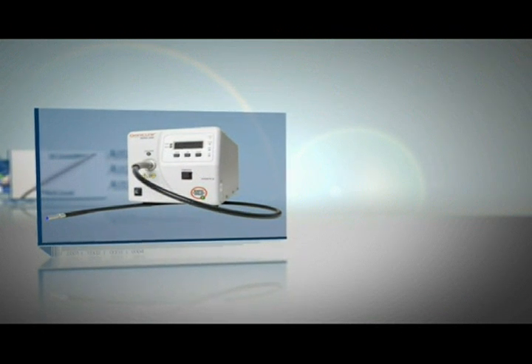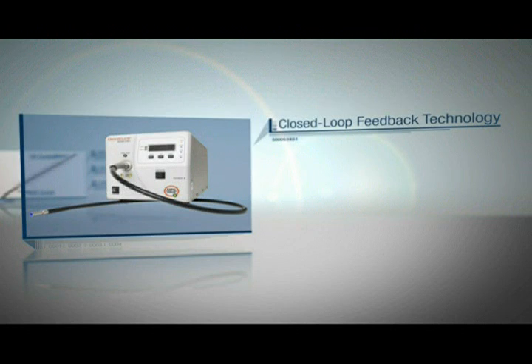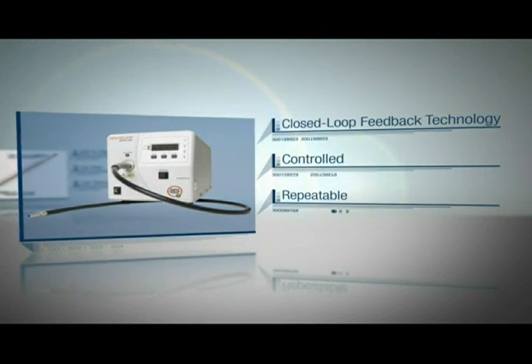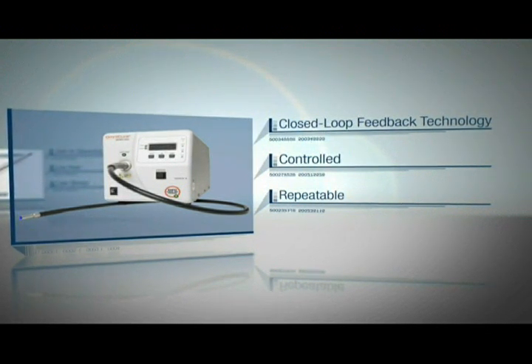The Omnicure S2000 UV spot curing system with closed loop feedback technology provides a controlled and repeatable curing process for your UV assembly of balloon catheters, ensuring quality parts are produced every time.